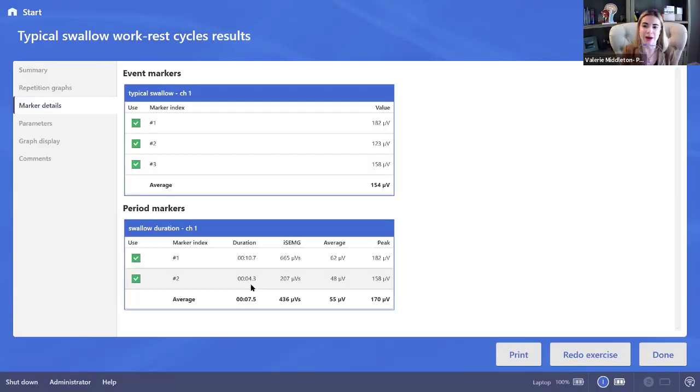And then of course you can always go back and edit parameters again for this patient. If they continued on this cycle where they're doing less than 10 seconds on average, I would probably, for the next session or maybe later in this session, change their work time to something less than 10 seconds. Perhaps next time we could try 6 seconds or 7 seconds to provide even more of a challenge.